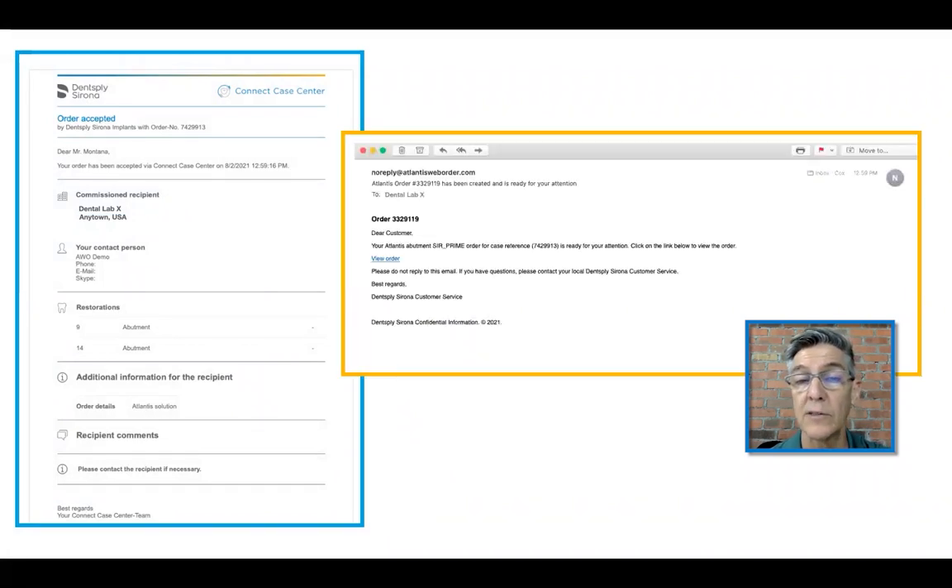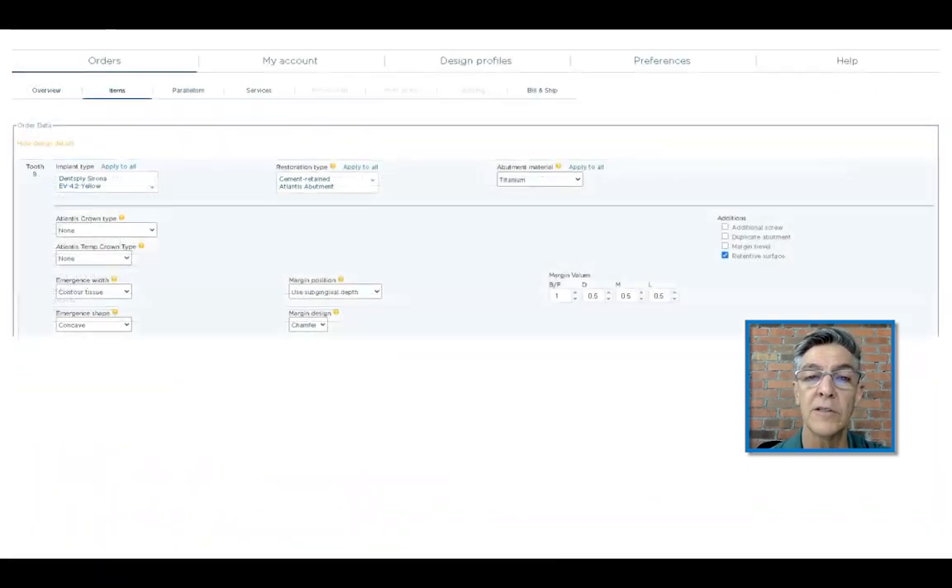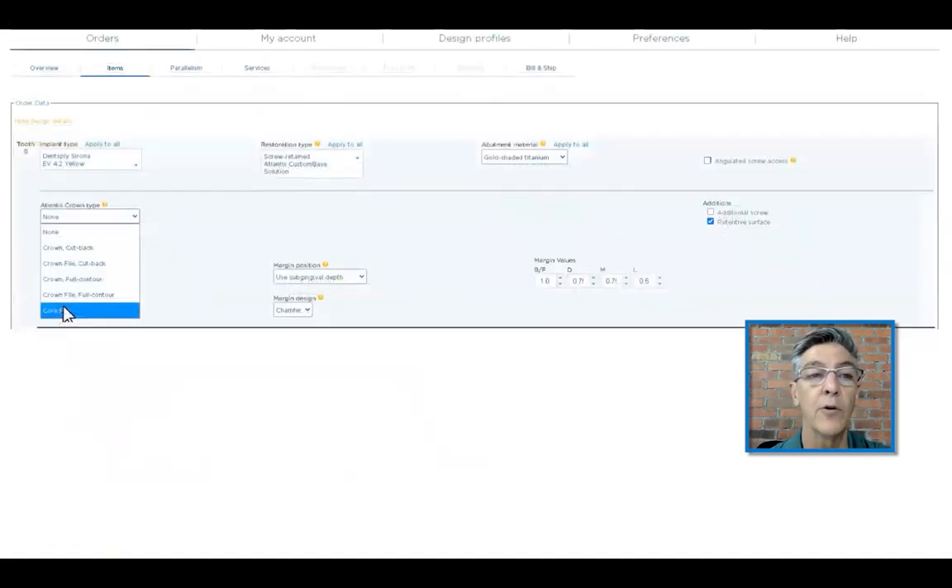At the laboratory level, they will receive an email from Atlantis saying go ahead and order the abutment. In Atlantis web order, your laboratory will then go through the steps of ordering the abutment. There's a drop-down menu, so they will choose Atlantis custom base. They have a choice between gray or golden colored titanium.